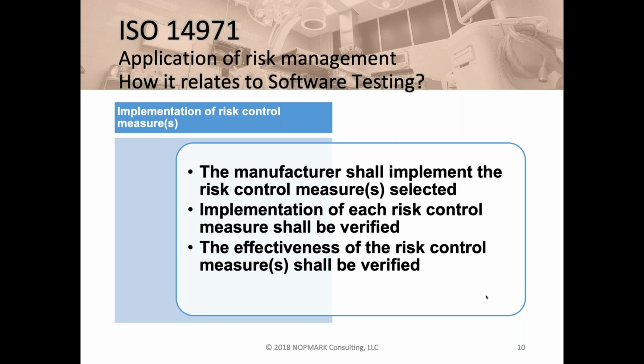If through that activity the team identifies that yes, something bad can happen, then the team creates some software design or software constraint that says, okay, then the software shall do X, Y, Z to prevent that harm from happening.